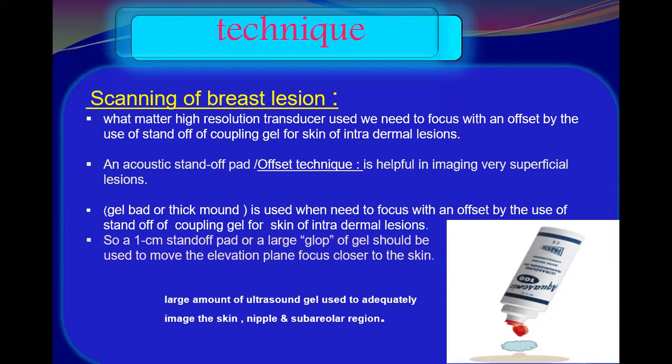You got it? Yes. We add some centimeters to the lesions to make them lie at 1.5 centimeter, where the elevation plane focus of the transducer is.